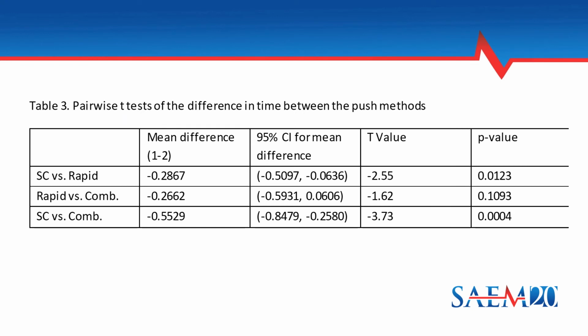In this table, we again demonstrate the breakdown between the three techniques, with the stopcock being the fastest and the rapid push and the combined techniques being slower.